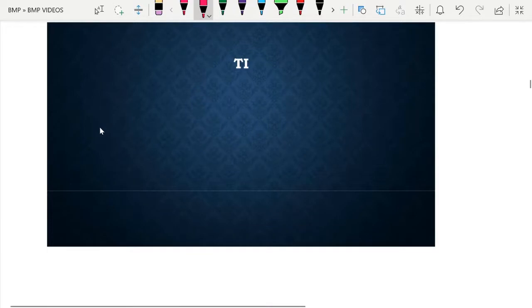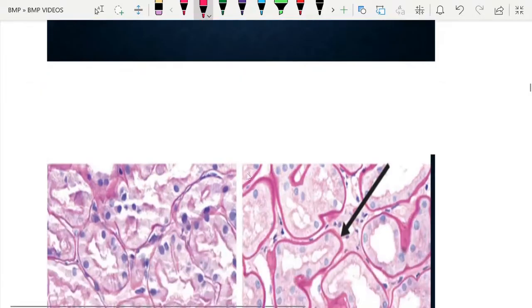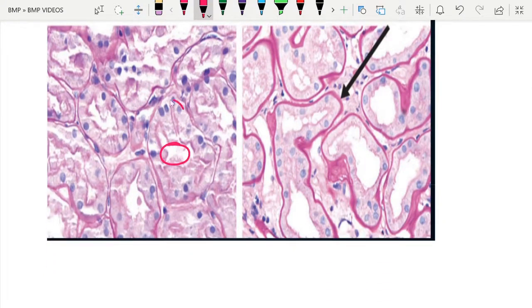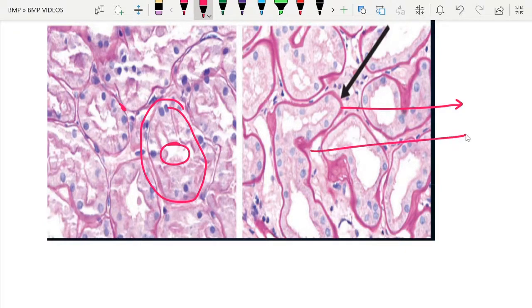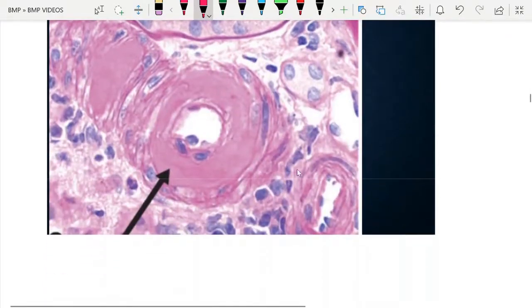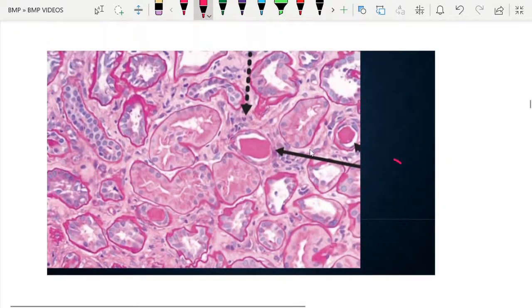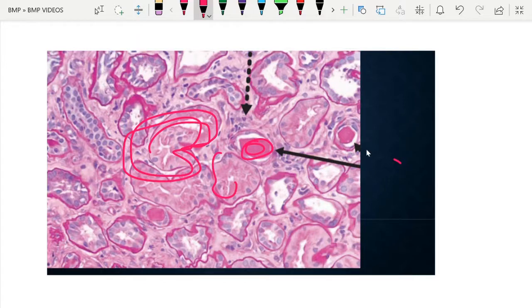Regarding the tubular interstitium, there will also be thickening of the tubular basement membrane resulting in wrinkling, along with hyaline accumulation. The images show normal tubular interstitial cortex biopsy with tubular epithelial cells, followed by tubular basement membrane thickening, wrinkling of the tubules, and hyaline accumulation within vessels — all characteristic findings in diabetic kidney disease.